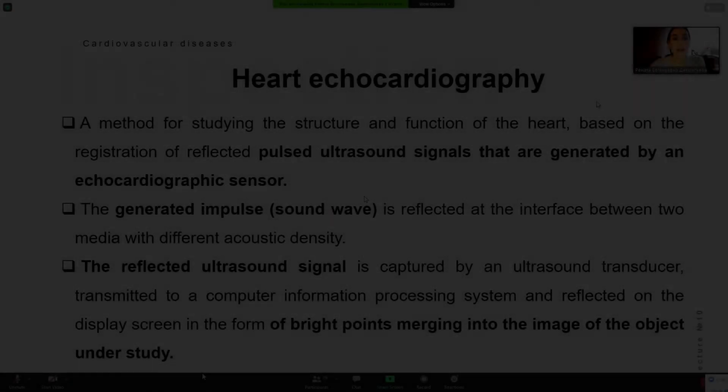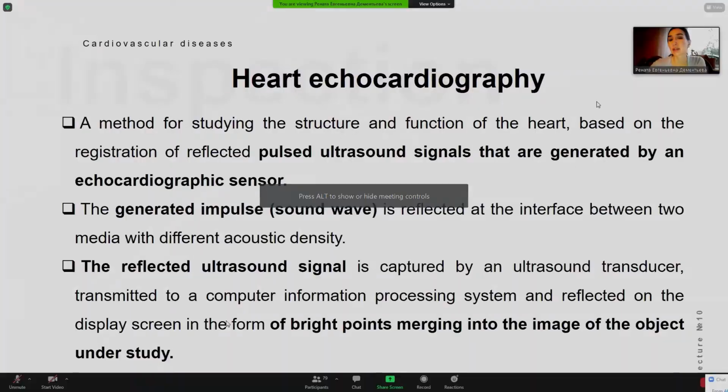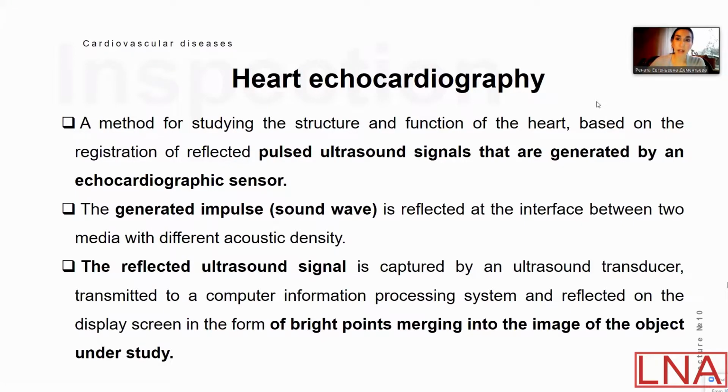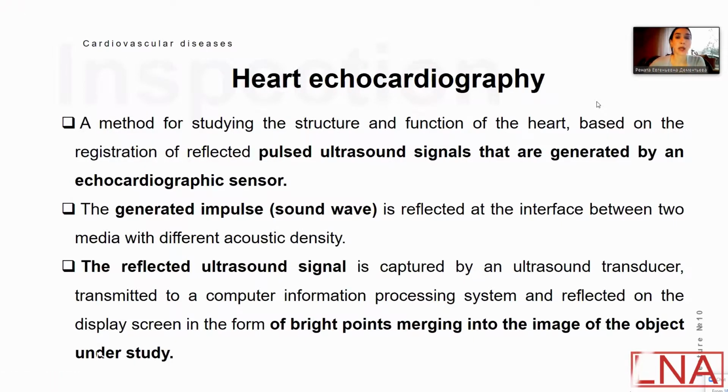Based on the registration of reflected pulsed ultrasound signals that are generated by an echocardiographic sensor. So it's usually an ultrasound method. There are two types of echocardiography, transthoracic, where the source is put exactly on the projection of the heart.